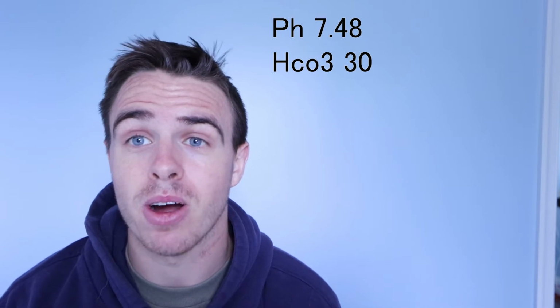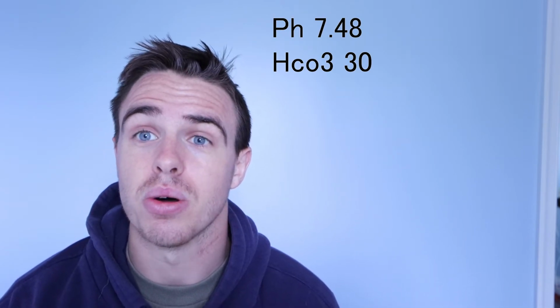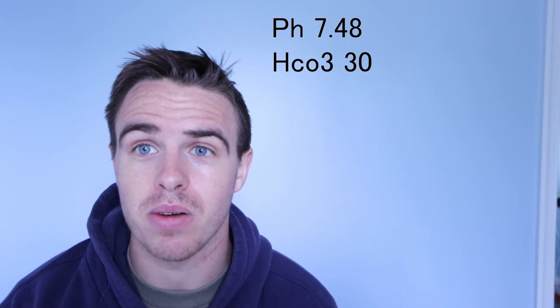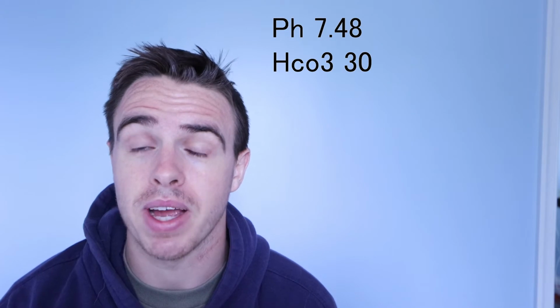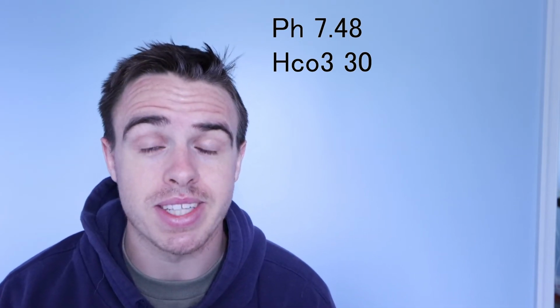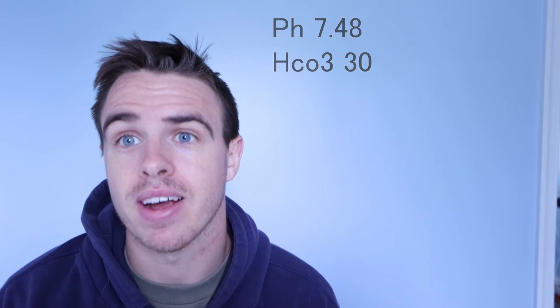The bicarb is the base and the CO2 is the acid. So right now we're just focused on bicarb and pH. The bicarb is the base, so we have more of the base. What is that going to do to the pH? It's going to make it more alkalotic.